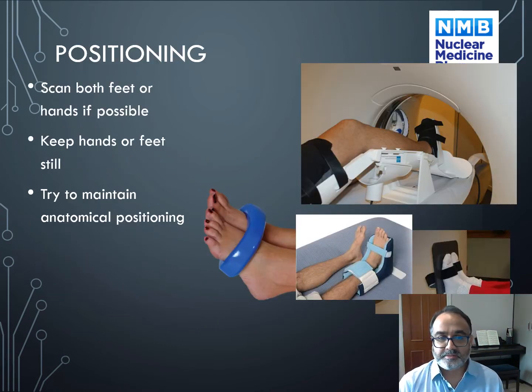When you're imaging the hands and feet, it's really important to take some time to consider positioning of the patient. It's really important that you try and image both sides at the same time, so you have the opportunity of comparing the left and right hands or feet.